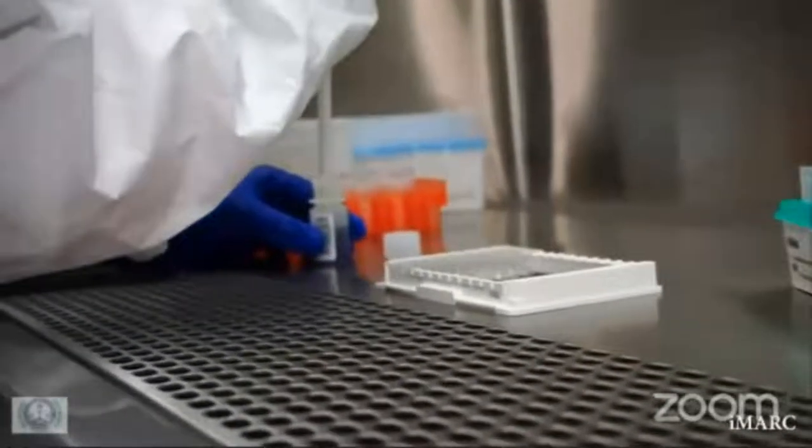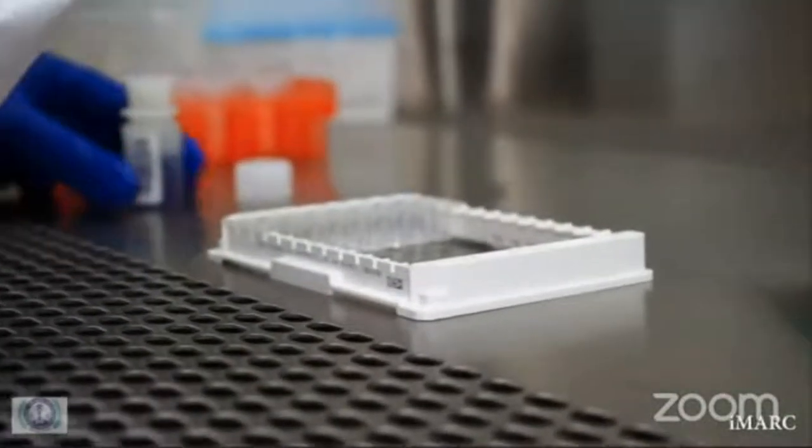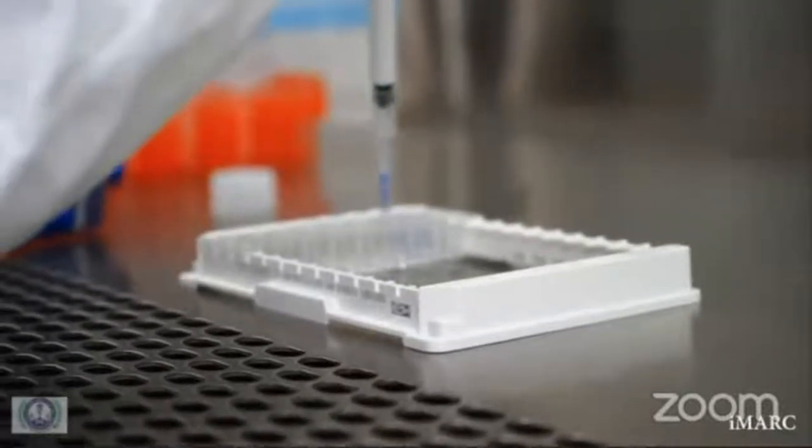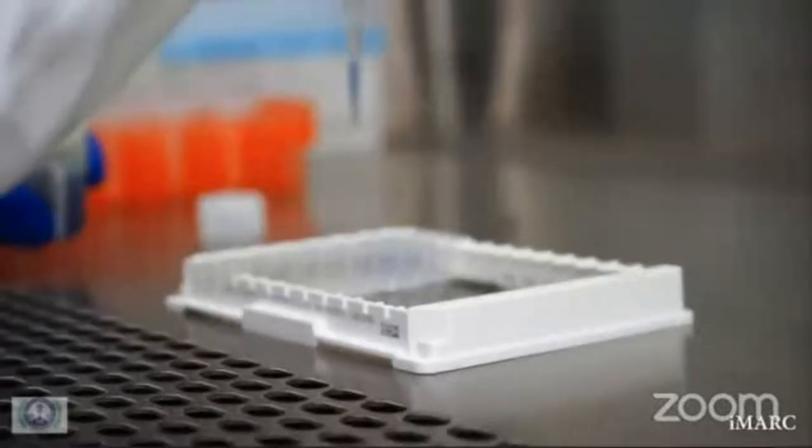After centrifugation, we will add R6, which is our conjugate and acts as a primary antibody. We will add about 50 microliters of conjugate to each well of the microtiter plate.